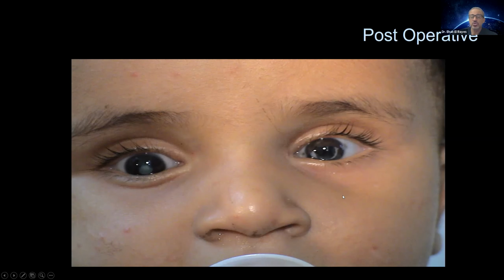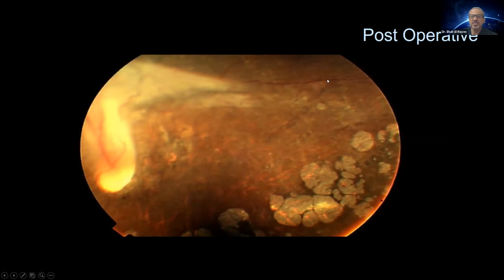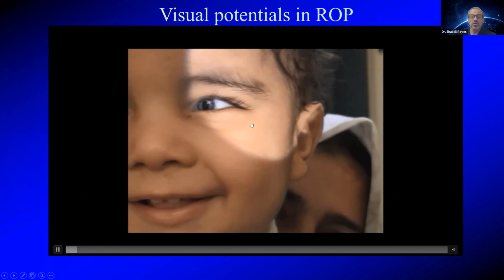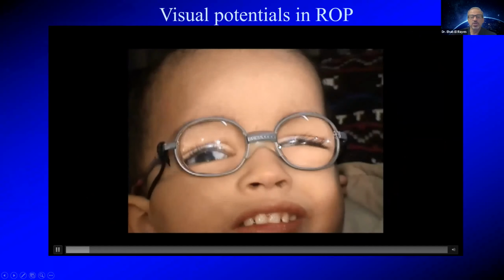He has some type of vision. What does the retina look like? If you wait for 6 months, it flattens up like this. Of course, there is a lot of RPE mottling from the lots of subretinal fluid that was there, some epiretinal proliferation, but the child has posterior pole attachment, which sometimes gives him good navigation vision. Like in this child, he's already now more than 2 years of age.